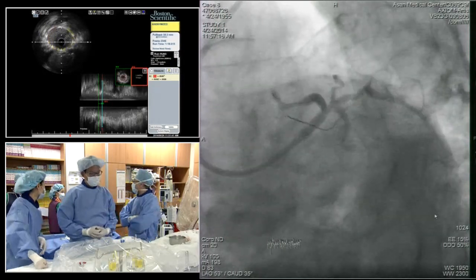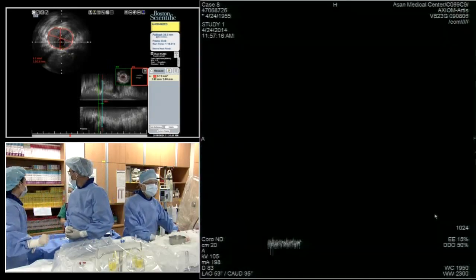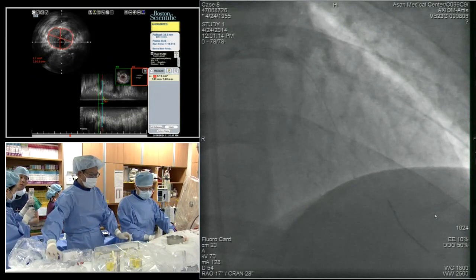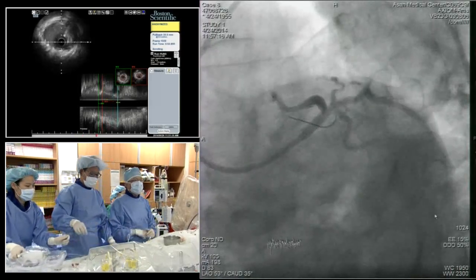The final minimal stent area at the left main is 9.3 square millimeter, and at the LAD ostium, it's 9.1 square millimeter. Very big stent. Well, I tell you, just by IVUS, if you wanted to do nothing, you could do nothing as well. Yeah. But it wouldn't hurt.